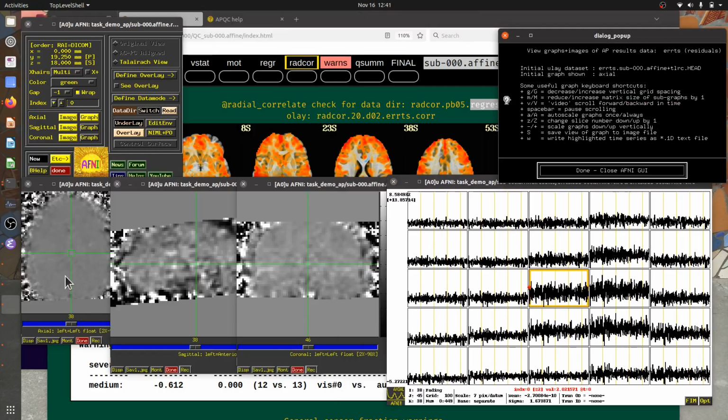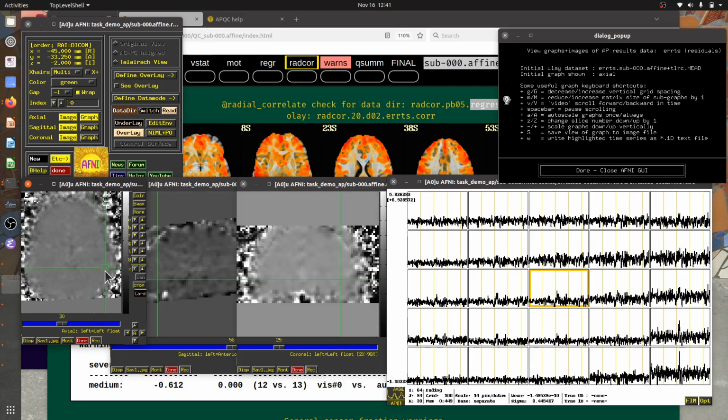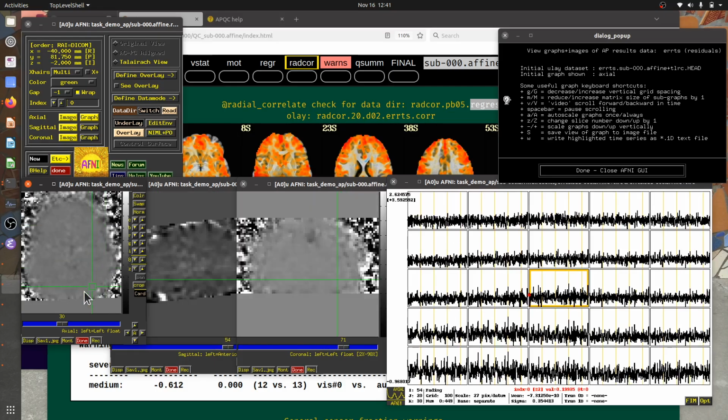This looks very different than before, because I don't really see gray-white structure, because this data has been scaled, so it all has a constant mean value, and the bold fluctuations, which are only of order 1 to 2 to maybe 3%, those are very small fluctuations. So I just see a little bit of fluctuation of this kind of mostly gray, but I do see there are real fluctuations in the time series. It's just they're all small with respect to the mean.